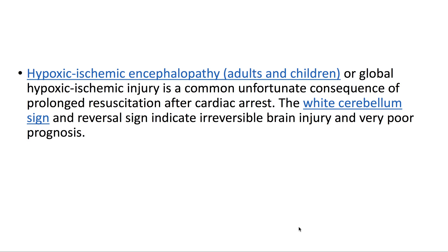Hypoxic ischemic encephalopathy, or global hypoxic ischemic injury, is a common unfortunate consequence of prolonged resuscitation after cardiac arrest. The white cerebellum sign and reversal sign indicate irreversible brain injury and very poor prognosis.